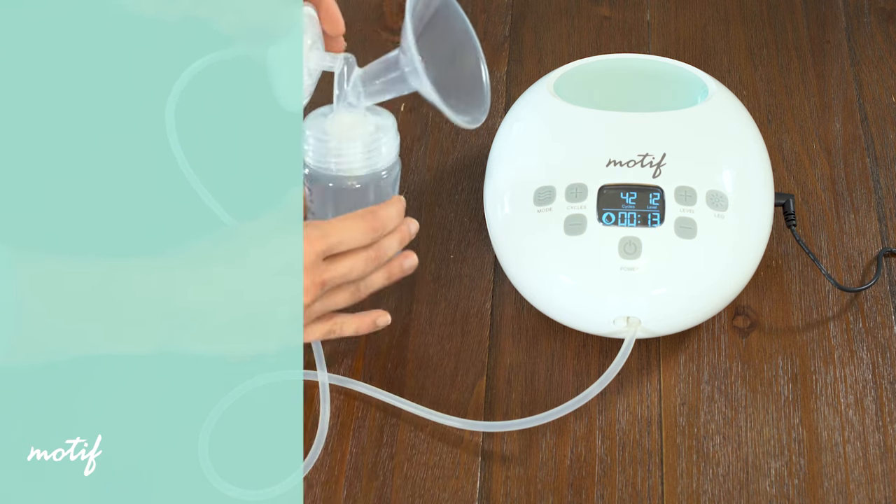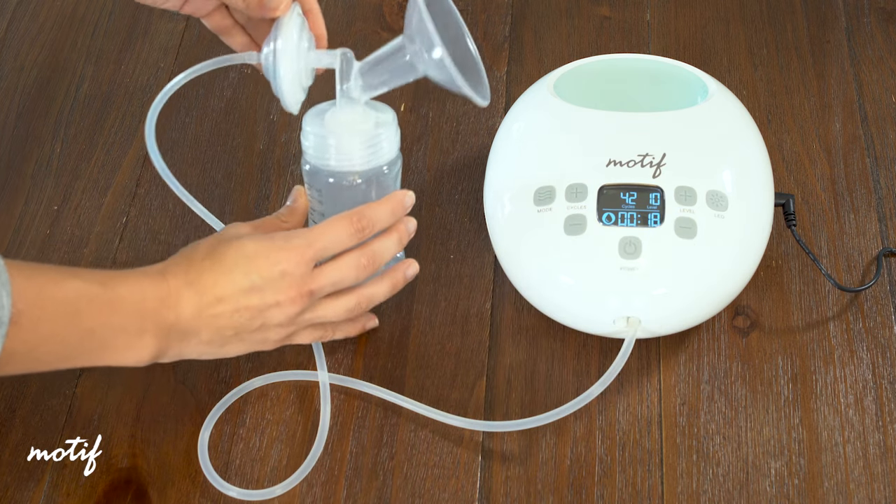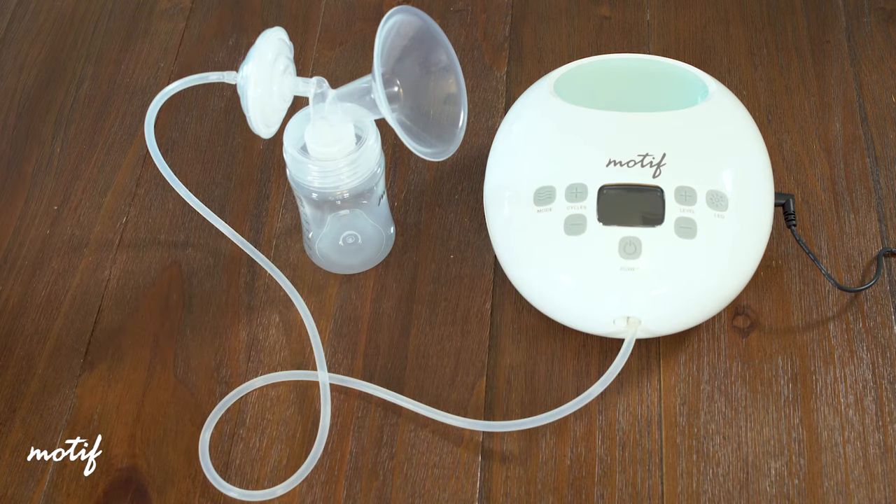Adjust suction to your preferred comfort level. When you wish to stop expressing, first press the power button, then remove the milk collection kit from your breast. You have just finished your first pumping session with the Luna.